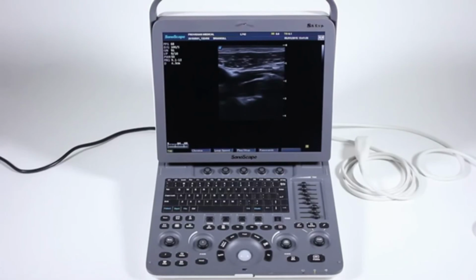Now, as we saw with the arrow earlier, you can press arrow, move it around, click the set key, and if I want to add another arrow, I press it again, and I can rotate that arrow this way. Press the set key, hit clear to clear the arrows.